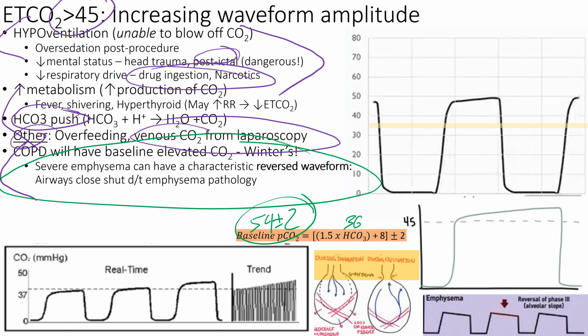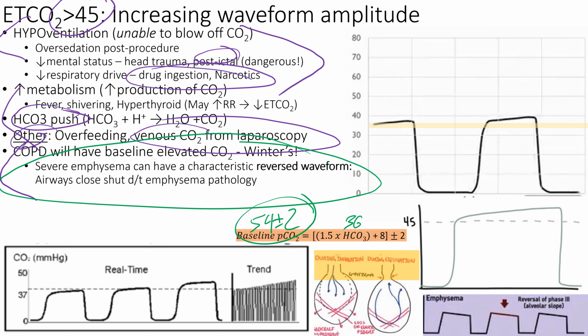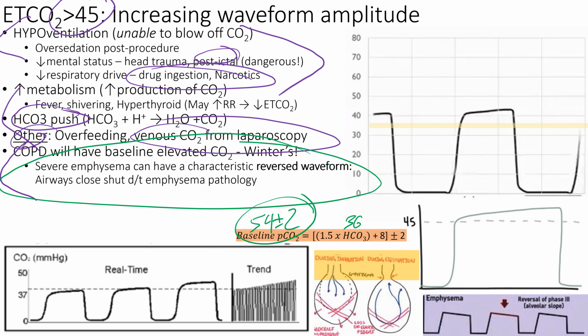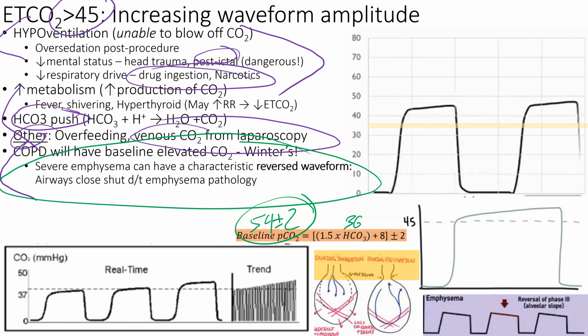That's where they should live, 52 to 56. So I'm going to take that. That's okay. My ABG shows 52 to 56. That is where they should be, right? And your end-tidal CO2 at that time will tell you, and then you can track and trend it. If the end-tidal CO2 starts going up and up and up, that means they might be developing too much CO2.